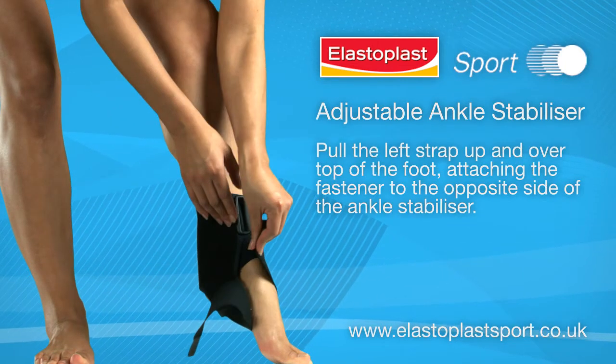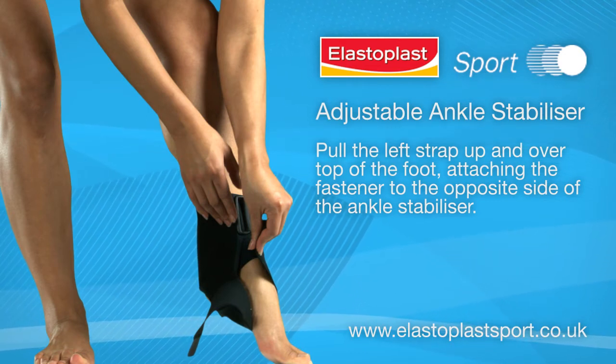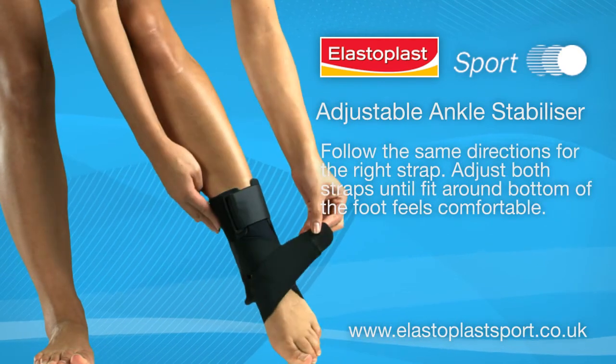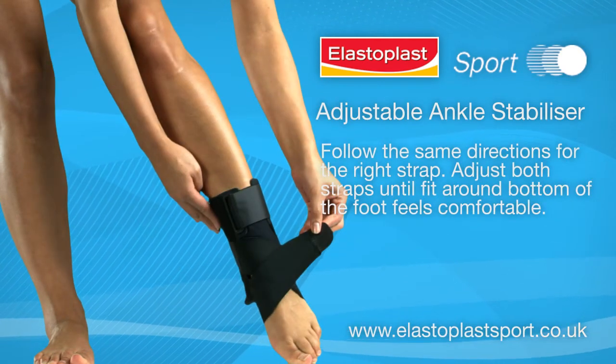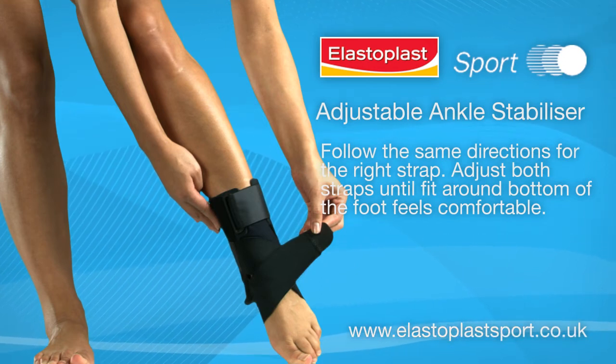Pull the left strap up and over the top of the foot, attaching the fastener to the opposite side of the ankle stabilizer. Follow the same directions for the right strap. Adjust both straps until the fit around the bottom of the foot feels comfortable.